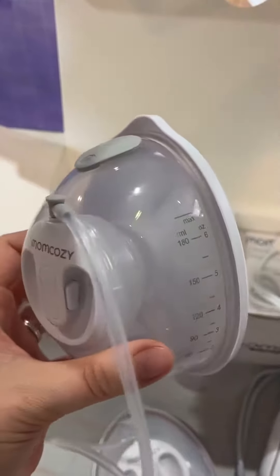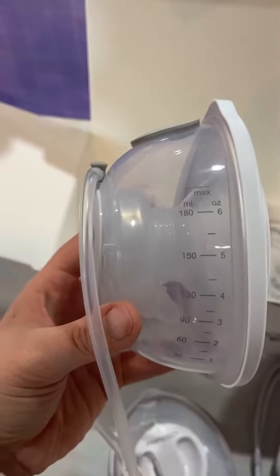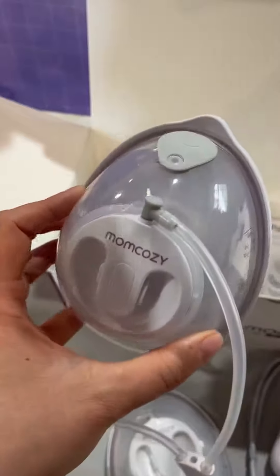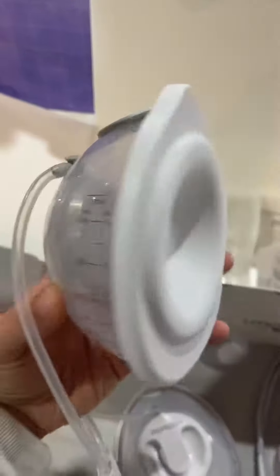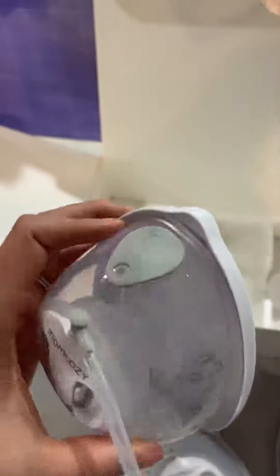Just to give you a close-up view of what the breast pump looks like itself — it's pretty much four or five different parts, that's it. All you do to take this apart is to clean it. It does have a plastic cover, so if you are traveling with these, it'll keep them covered and a little bit more sanitary.